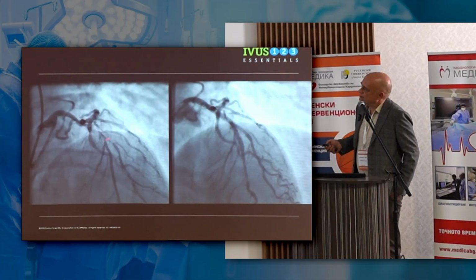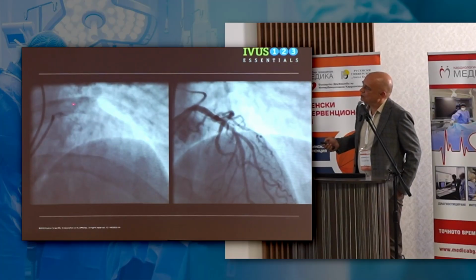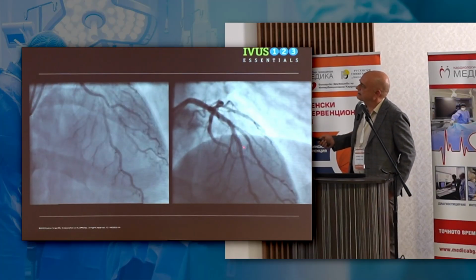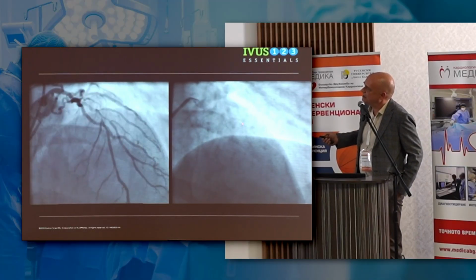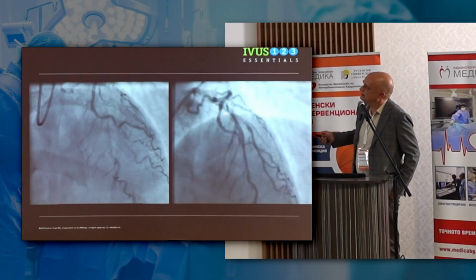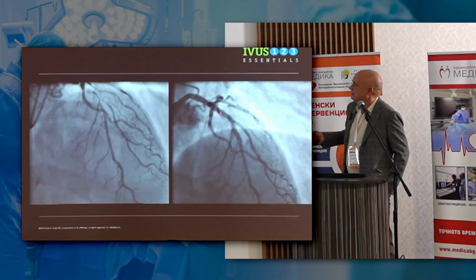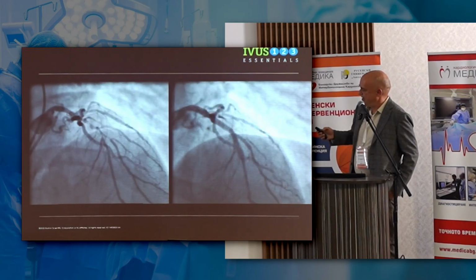This patient has one additional complex bifurcation lesion, a site of long disease over the left main, and they treated this with a mini crush technique, and the first diagonal was occluded after intervention with, I think, peri-procedural MI.